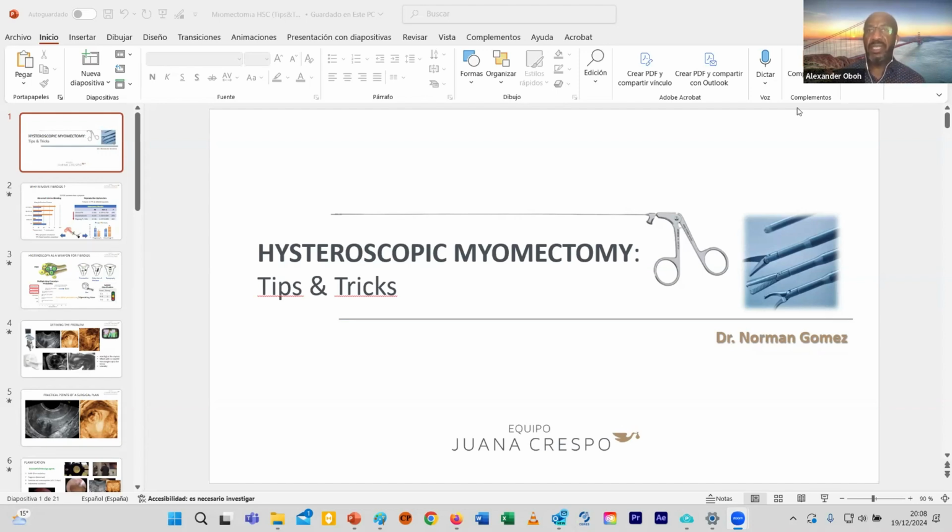Because with resections and adhesions, we don't have good quality adhesion prevention methods. We've had this debate about using the balloon, whether silicone or rubber, and we've talked about IUCD and barrier adhesion prevention gel. There's no quality evidence. Somebody presented something at the AAGL in New Orleans this year, but still no quality evidence to suggest what is the safest and best thing to do. So if we can get away with using the cold technique, we may be helping our women in Nigeria reduce that risk. It's a steep learning curve, but it's learnable, and we can do it.